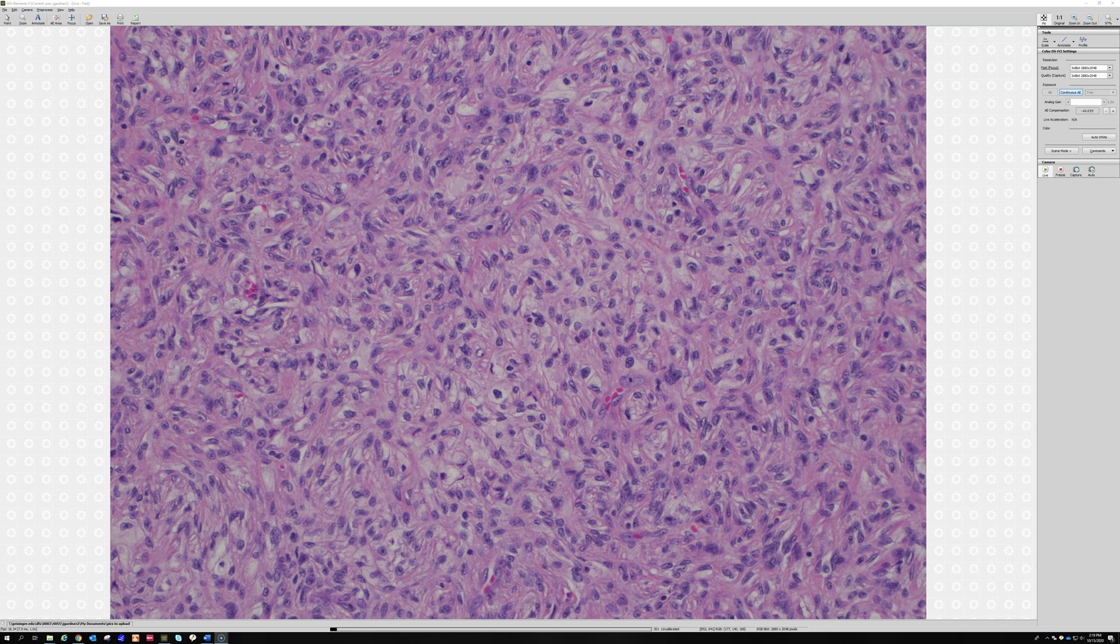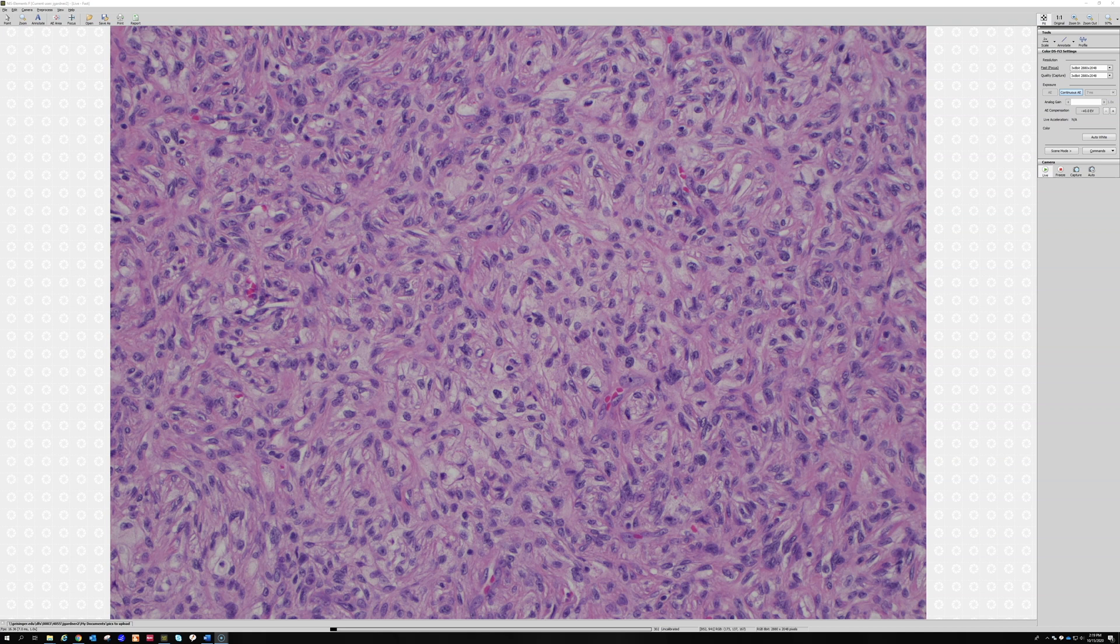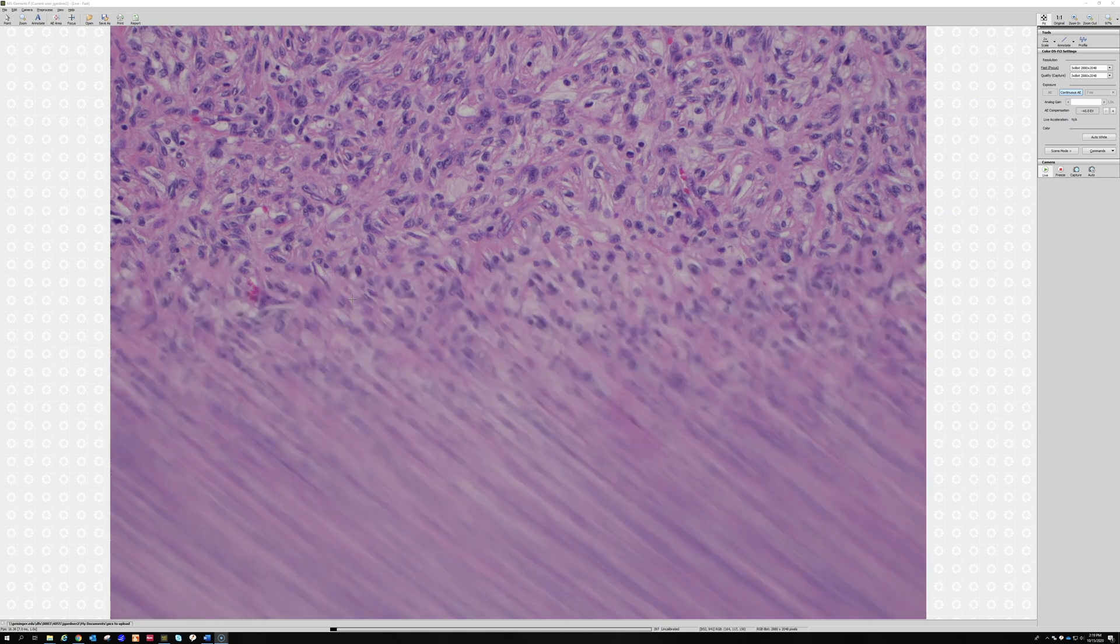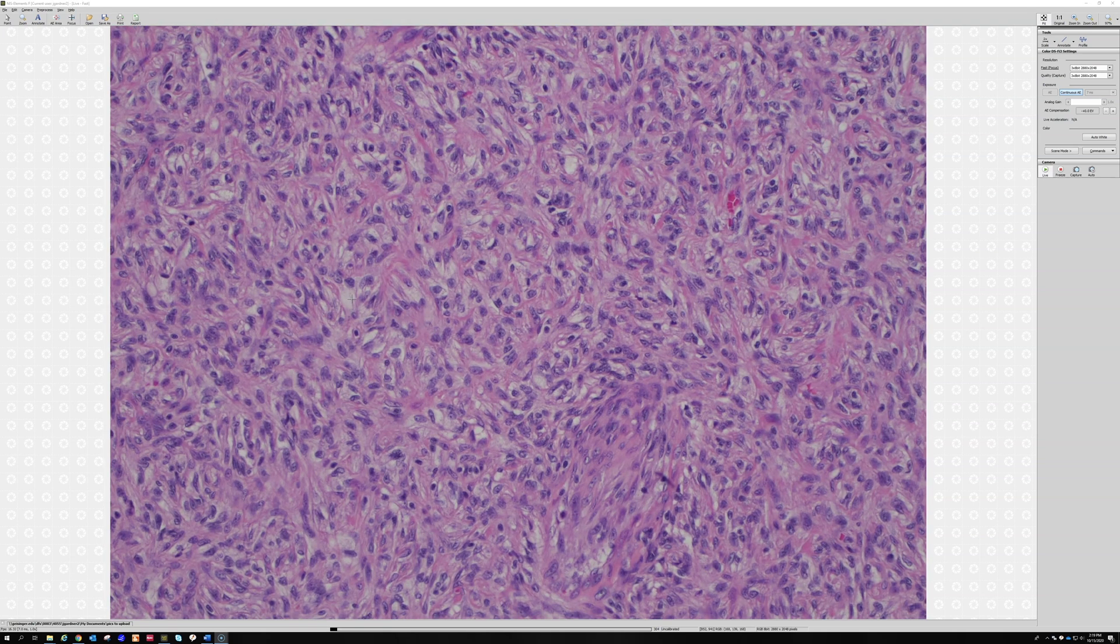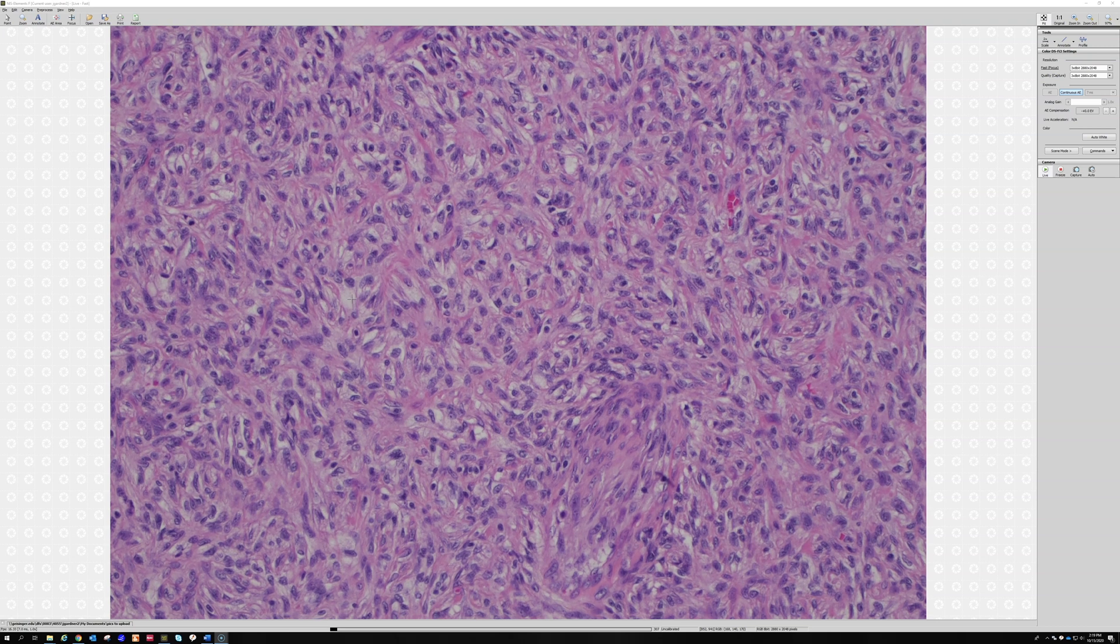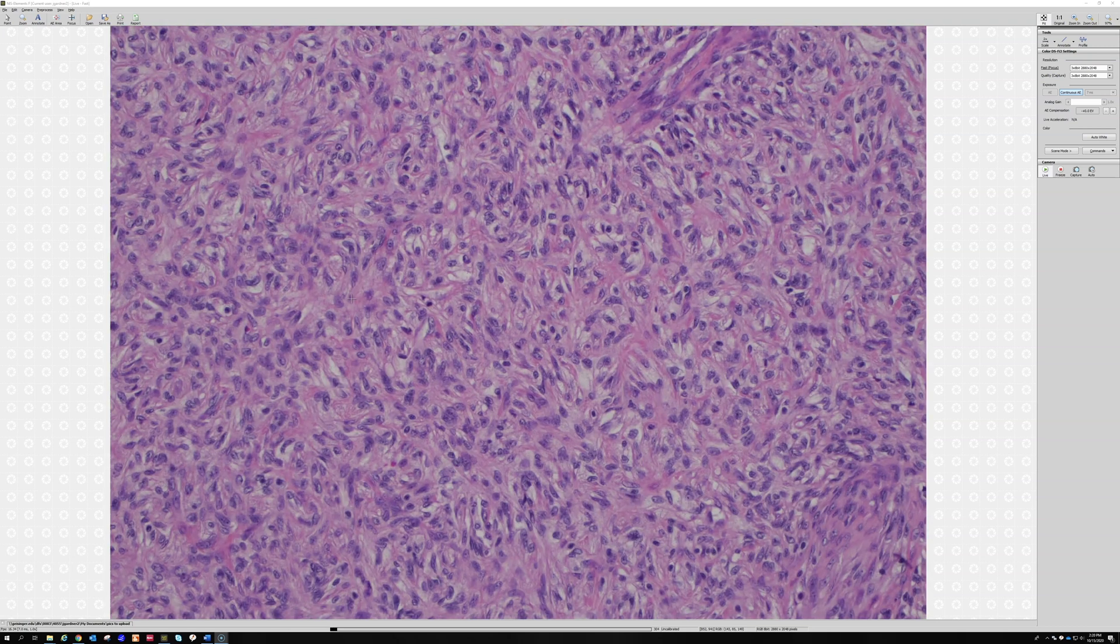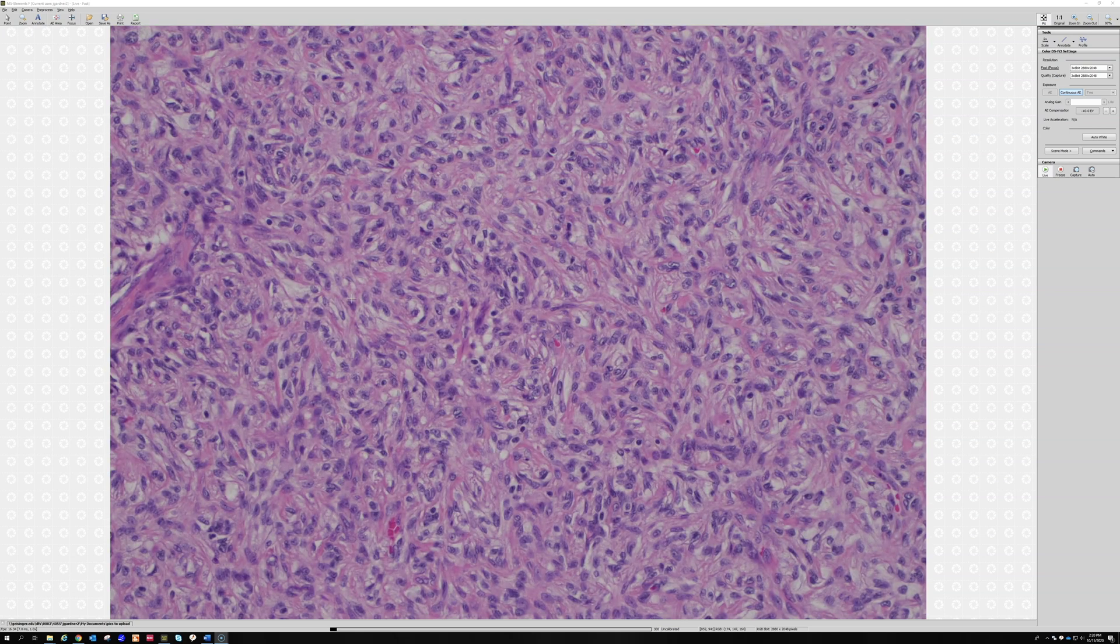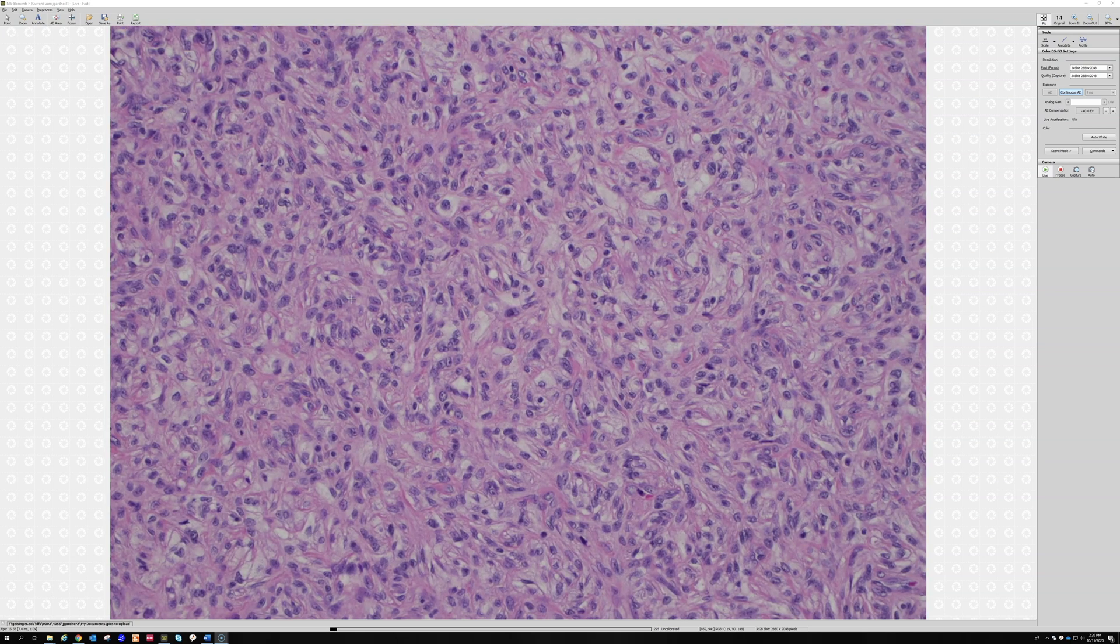The reason I knew that this is from the lower leg: I remembered the case once I saw it, but more importantly, when there's abundant foamy cells in a dermatofibroma we call that a lipidized dermatofibroma. The other name for it is ankle type dermatofibroma because they usually occur at the lower leg or the ankle region. Leg type is for a lymphoma, for a type of diffuse large B-cell lymphoma in dermpath. We love to do that, that's the way we are as dermpaths.